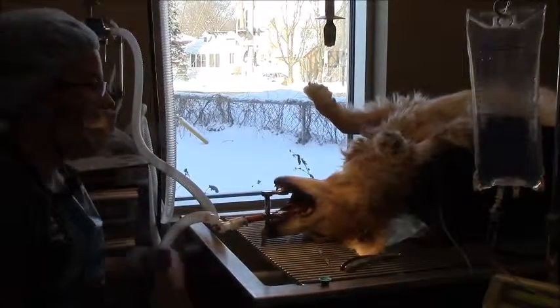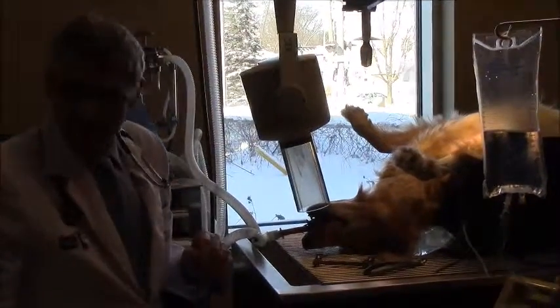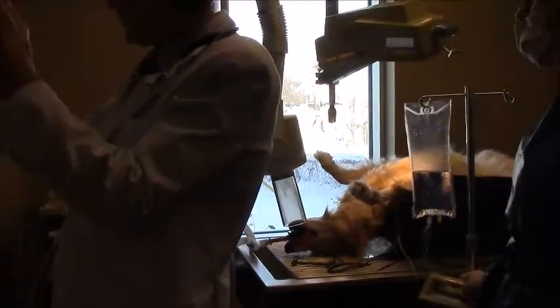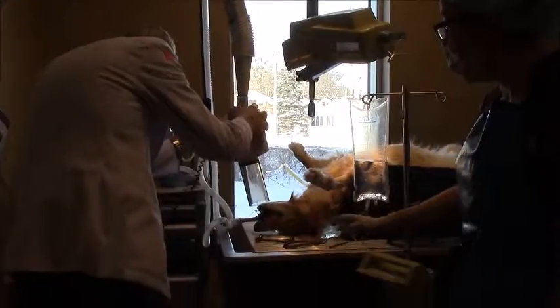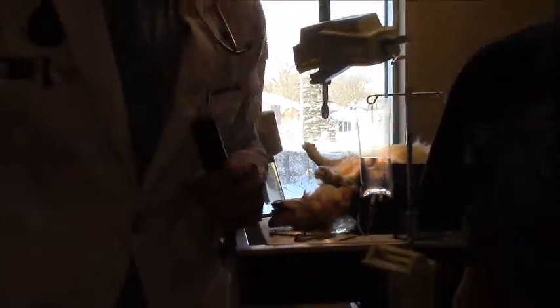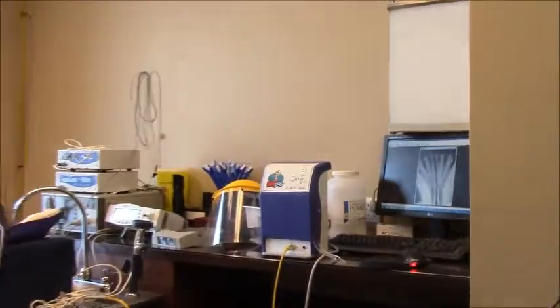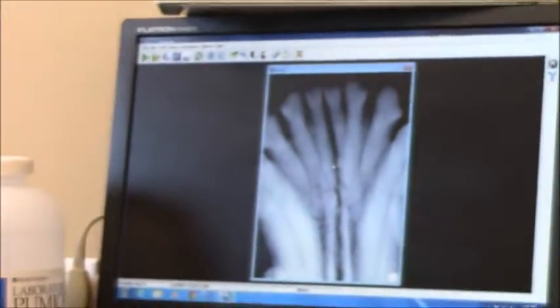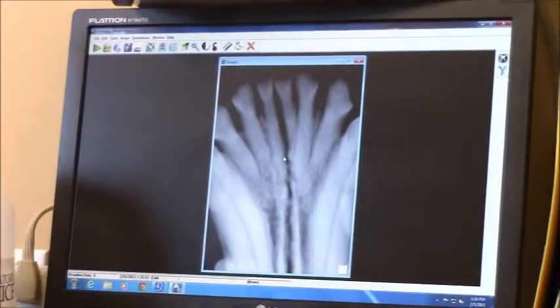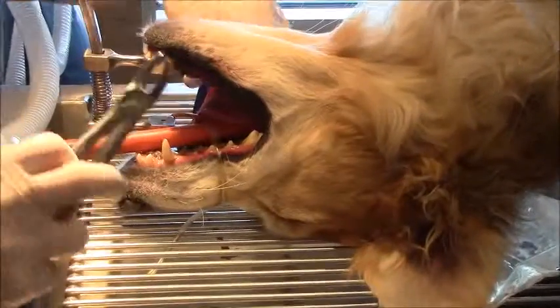Once I'm done, I will evaluate the mouth again and let Dr. Viranowski know so he can come check. We found a questionable area on her lower incisors, so we're going to take an x-ray. We're all set up, so we'll just walk out of the room for a second and set up the dental screen to take the x-ray. Here's our x-ray — you can look at it right there. We can see there is a little bit of bone loss, but the teeth are very healthy and there's no abscess. We're looking at the six incisors, so I'm going to be removing the tartar buildup on some of those back premolars.